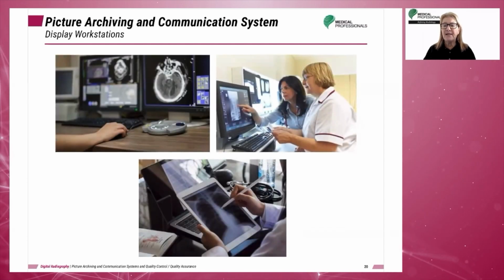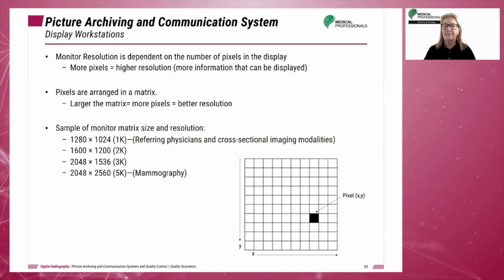Here we see a sample of LCD monitors, which predominate in medical imaging due to the size, price, and quality. Workstation monitors for medical imaging must be of higher quality than monitors used for other applications.